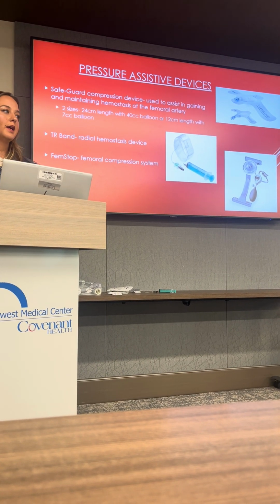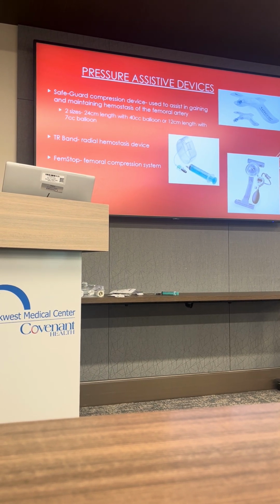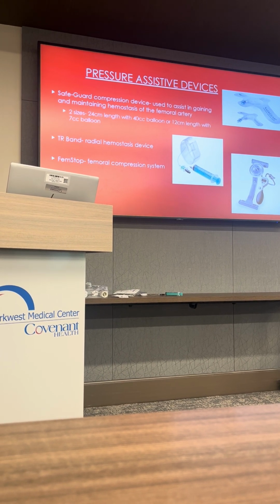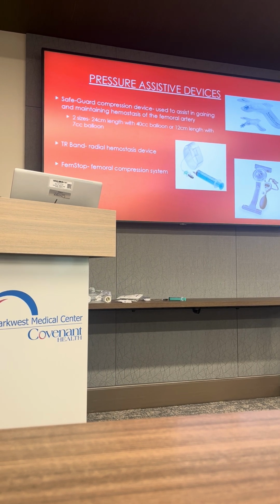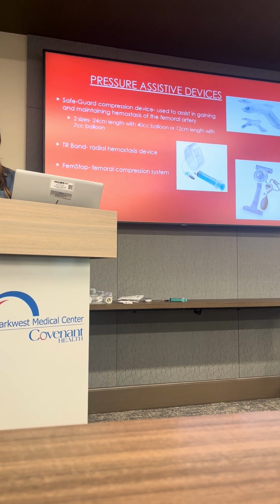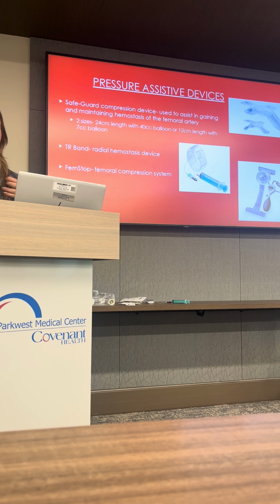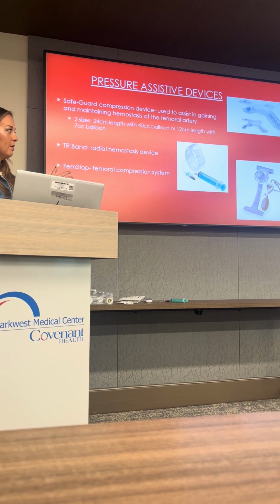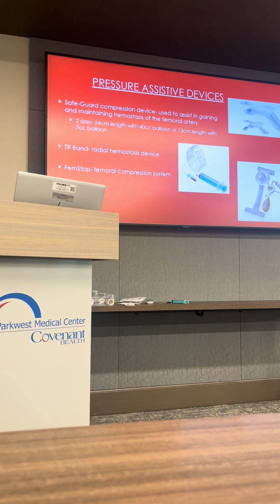The biggest thing with all of these devices is that we're still checking pulses, we're still checking cap refill. The last thing that we want to do is cause anyone to have some vascular demise because we've left these in place for too long and caused further complications. We don't want to do any harm in these patients by any means. Sometimes we can be slightly negligent by not checking these and just giving them full credit for doing the job they're meant to do, but we leave them in place for too long and we can cause further issues.